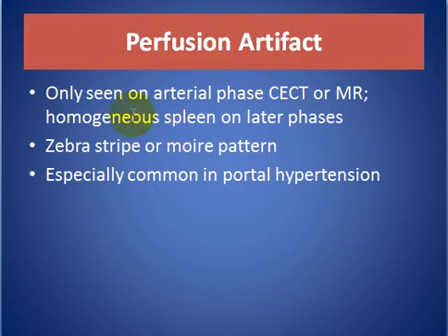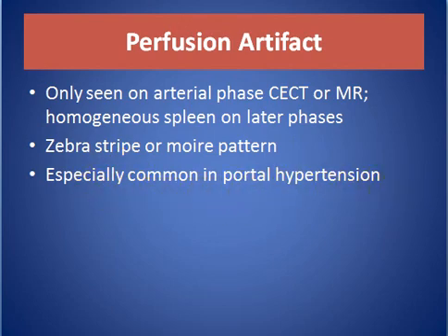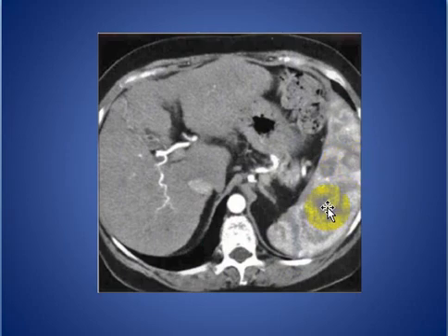Perfusion artifact is only seen on the arterial phase on contrast-enhanced CT or MRI, with the spleen becoming homogeneous on later phases. As seen here in the arterial phase, there are zebra-like perfusion defects in the spleen, which disappear on the portal venous phase.